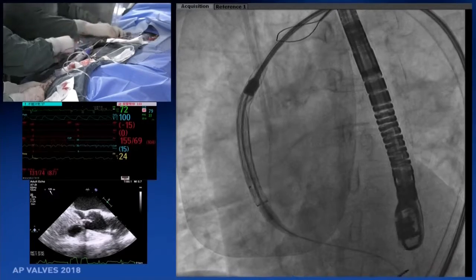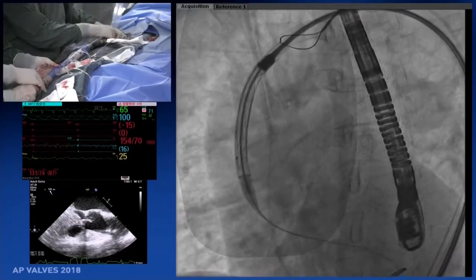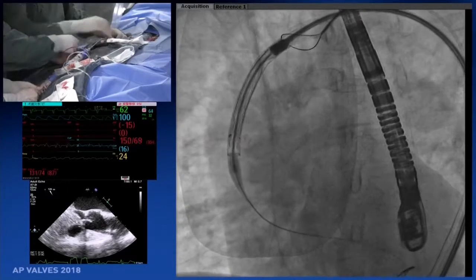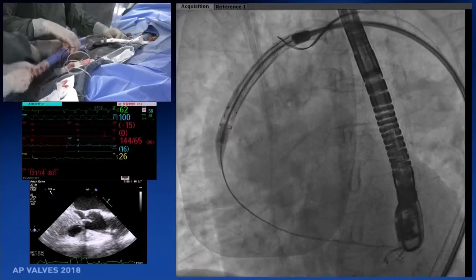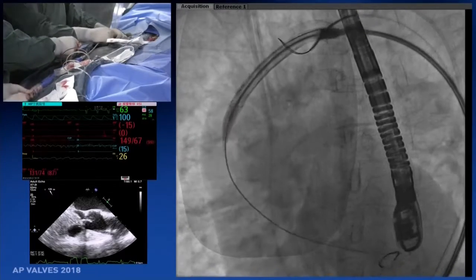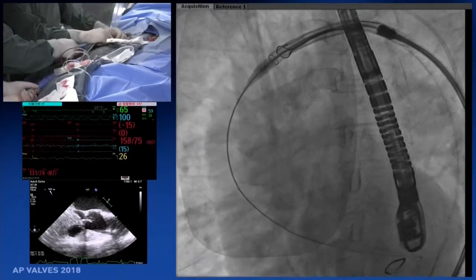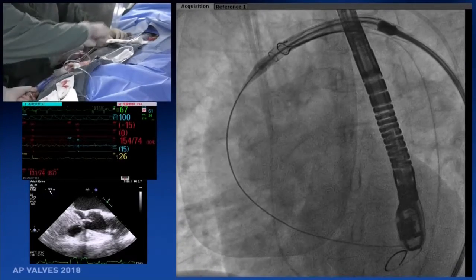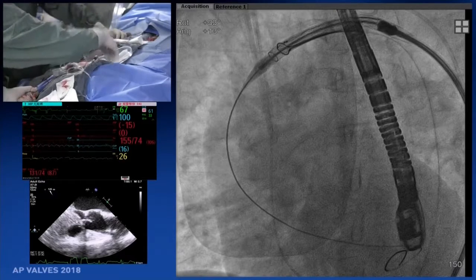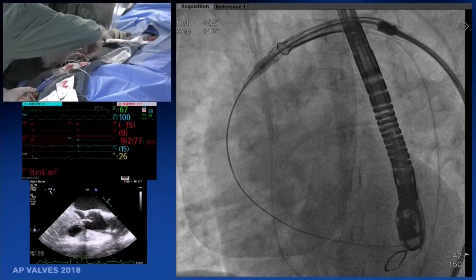So I think if he can get the snare to go down, and basically pull horizontally and release it there. But I don't know how, you know, this is tough because this is a very, very stiff capsule. And no matter what you do, it's probably going to straighten up and make it difficult to release. You see, here you can see where the valve and the snare are trapped in the aorta and the catheter right now. He's going to pull the snare down, I think.